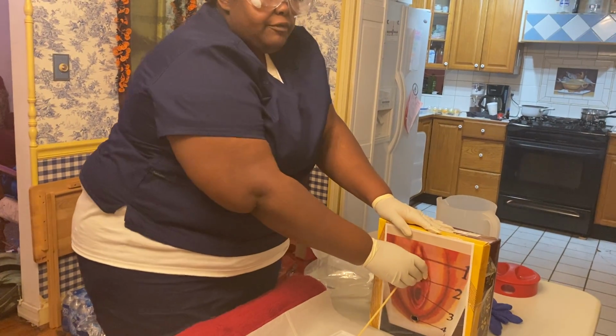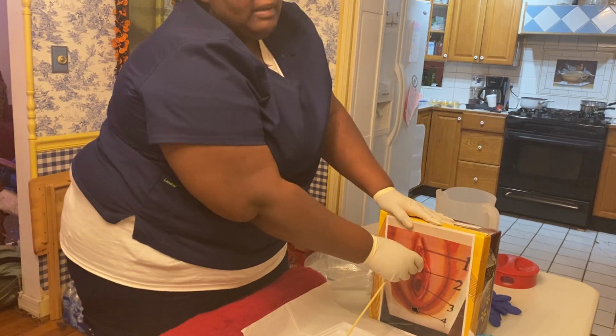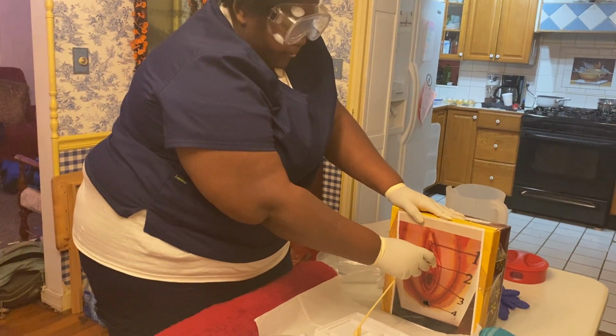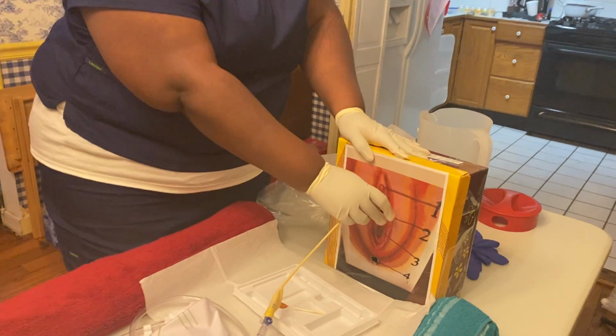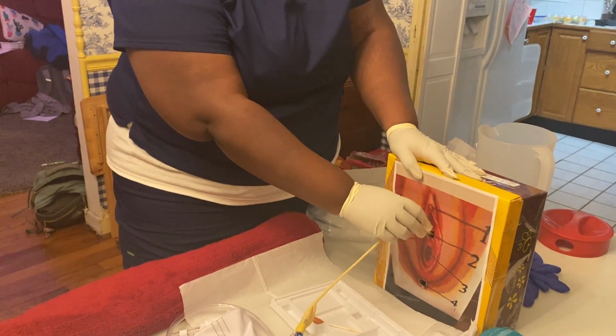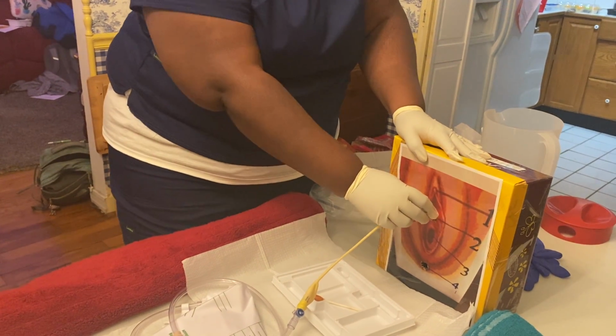Once it's inside 1 to 2 inches, I will tell my patient to breathe through it. For women, I can go in another 1 to 2 inches, but for males, I go all the way in until bifurcation.